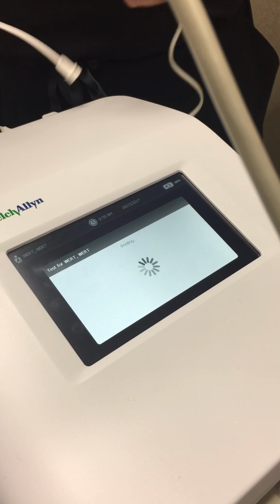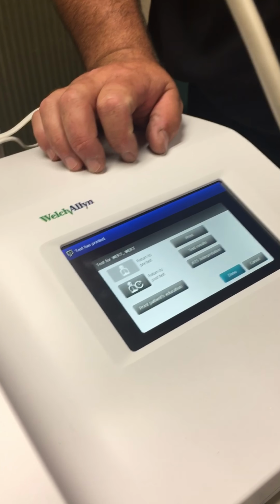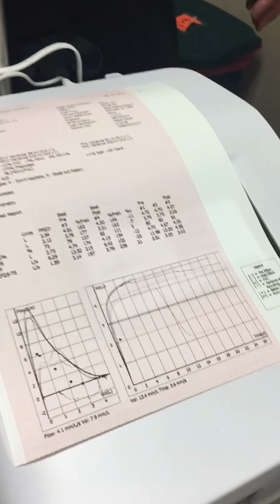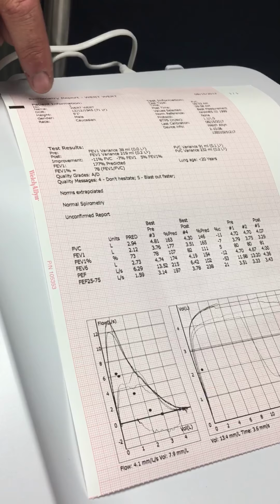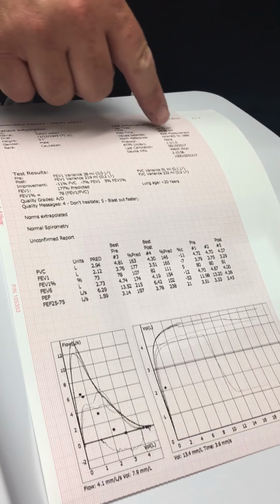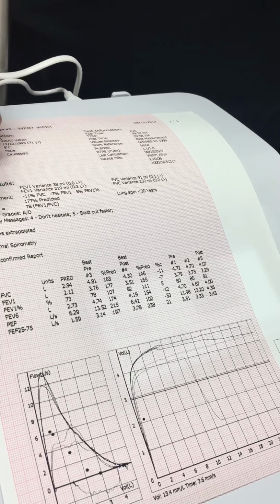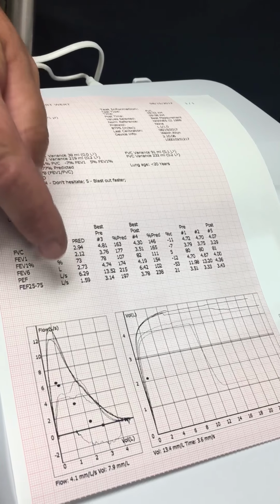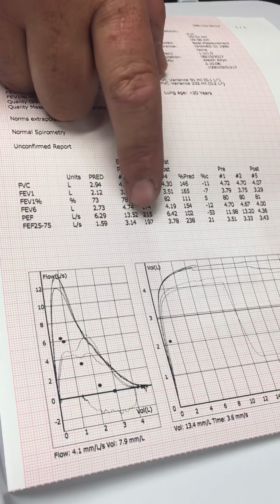So on this machine though, on this printout, couple things. When you look at this printout, you've got the patient's information up here. So all of this information was plugged into a predicted norm, which is right here. So NHANES 3, 1999 said this patient, their goal should be 294, 212, right down there in the predicted. Anything 80% and above is normal spirometry.